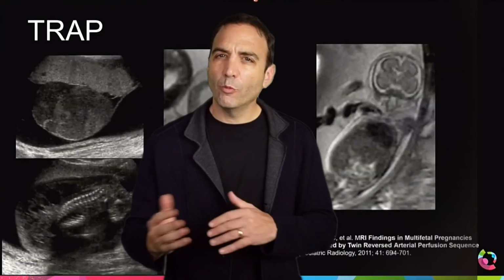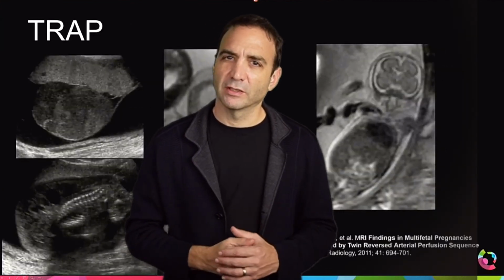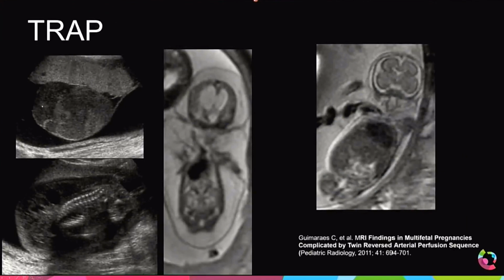And what do they look like on ultrasound imaging? An acardiac twin can look like anything from solid tissue to dysmorphic tissue with swelling to a fully formed twin that mimics the appearance of a discordant twin. Here is the pump twin. When very sick, you can see the heart gets very big and the twin is very hydropic.